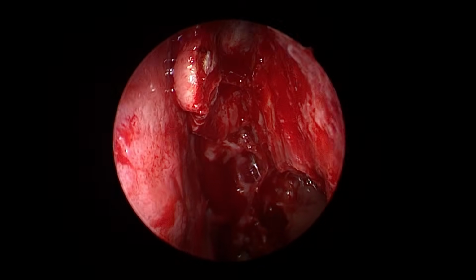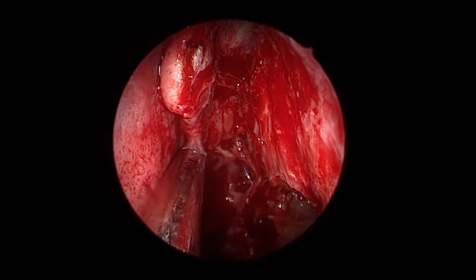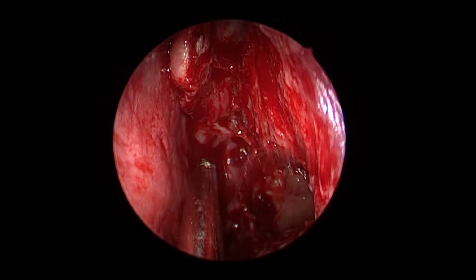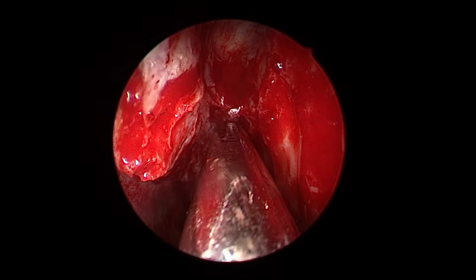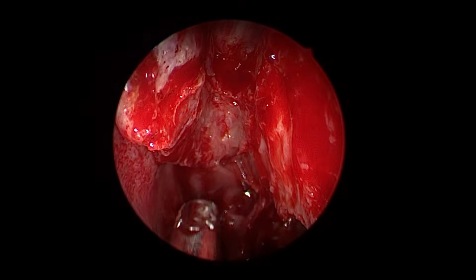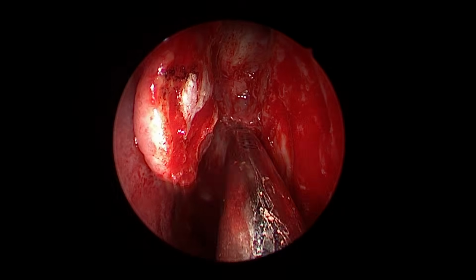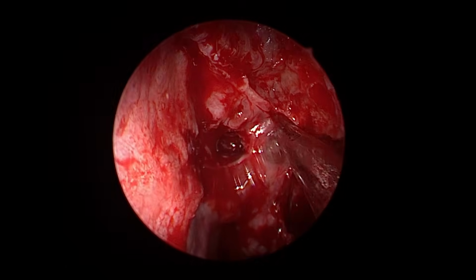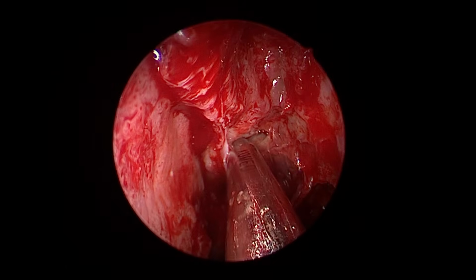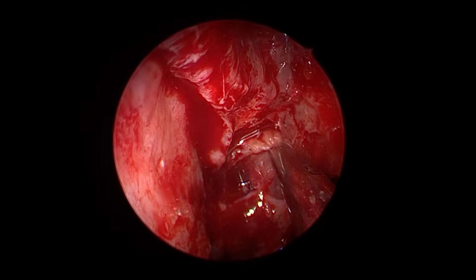Okay? See, more and more I am dealing with the turbinate. I have used this as a landmark. Still I am keeping it as a landmark. But make sure that this doesn't remain floppy. See now, the entire skull base, the anterior ethmoidal skull base, the maxillary sinus, and now I can finish off the remaining post-ethmoidectomy. See this?